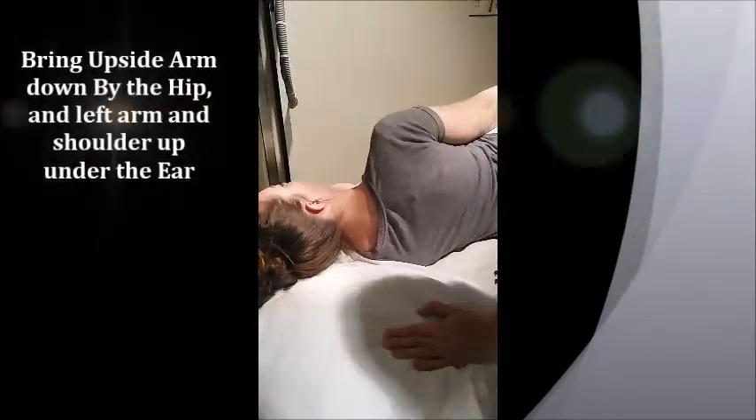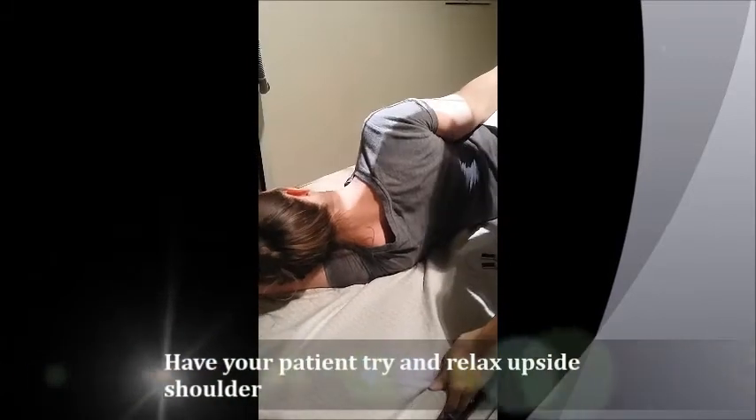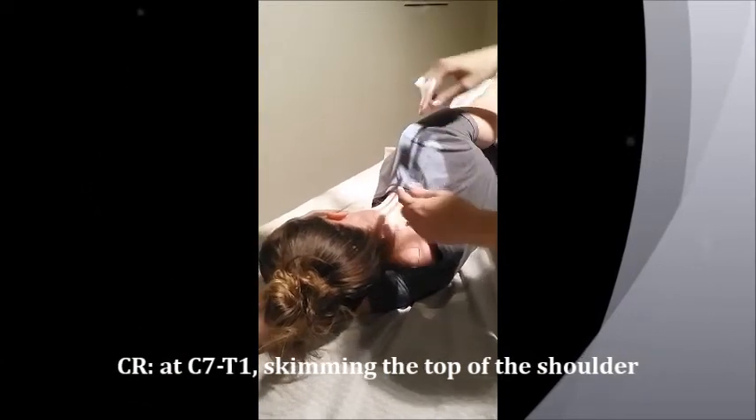What I'm going to ask her to do is bring the arm that's up down by her hip, then I'm going to remove her pillow and she's going to bring that arm so her head is laying on it — like she's swimming. The centering point for this is right at the cervicothoracic junction, which is basically skimming the top part of their shoulder, right where the neck and shoulder meet.